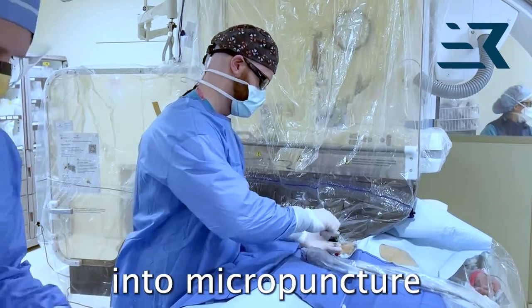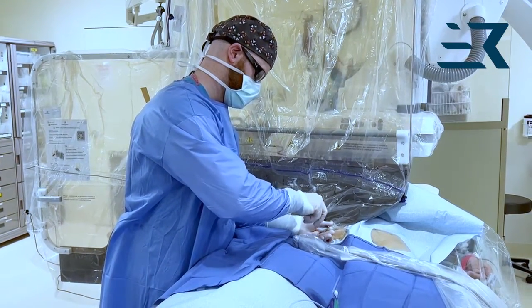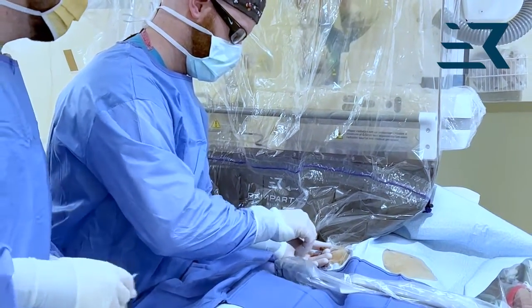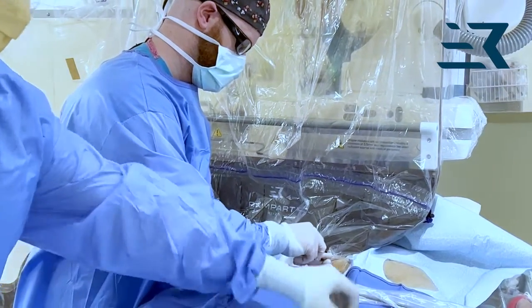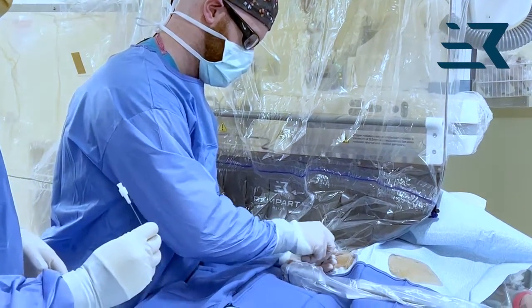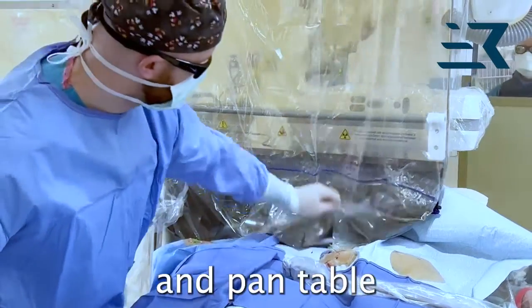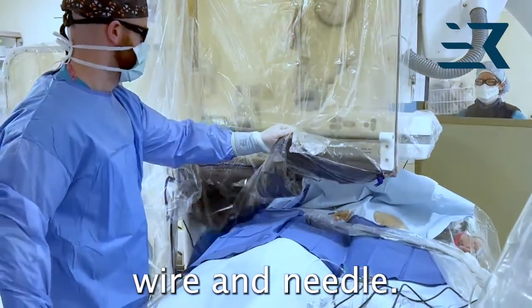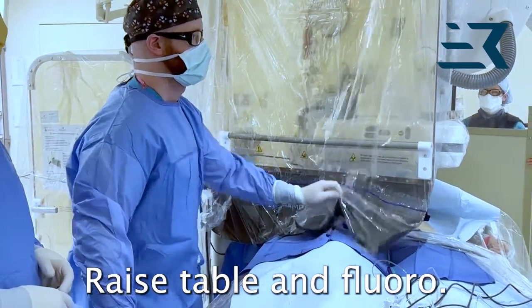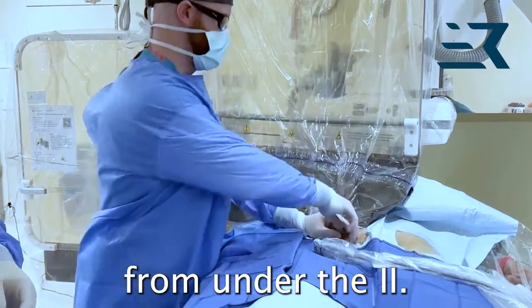Insert wire into micropuncture needle. Lift rack and pan table to visualize wire and needle. Drop rack, raise table, and fluoro. Lift rack and pan table out from under the II.